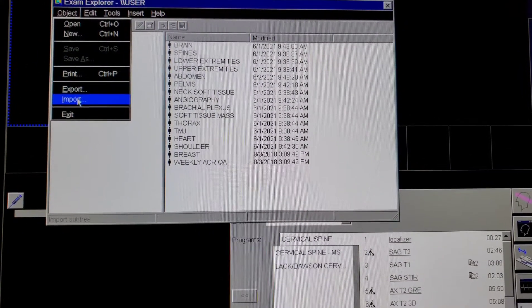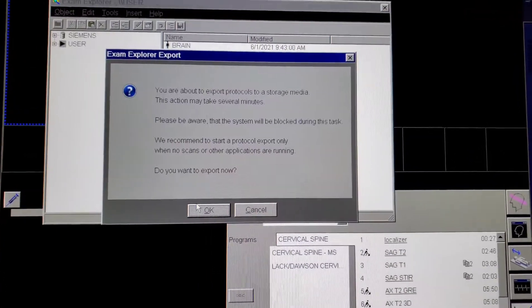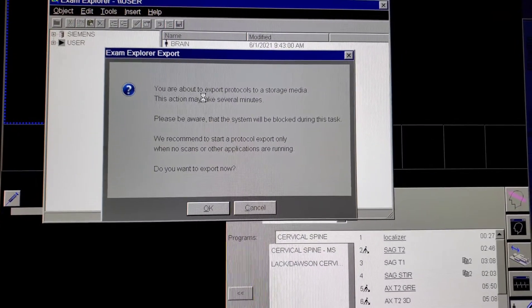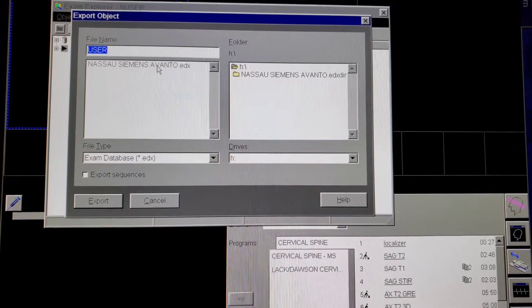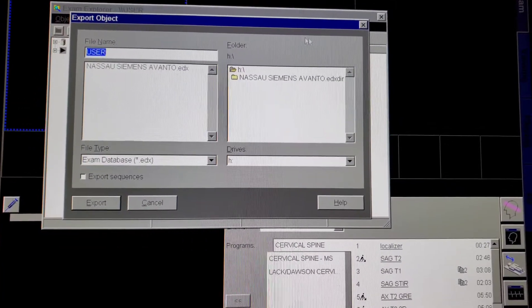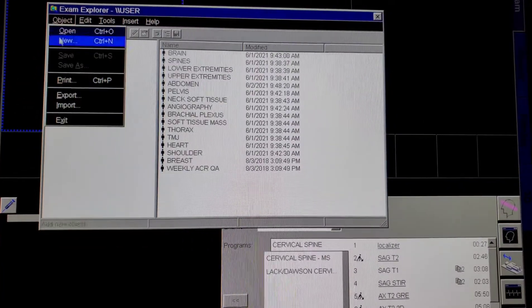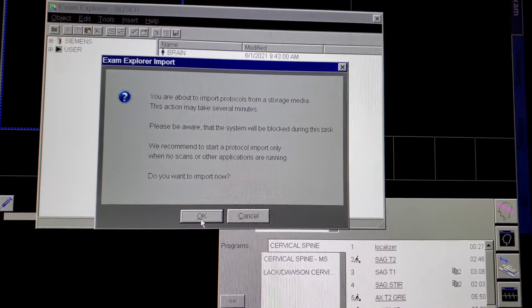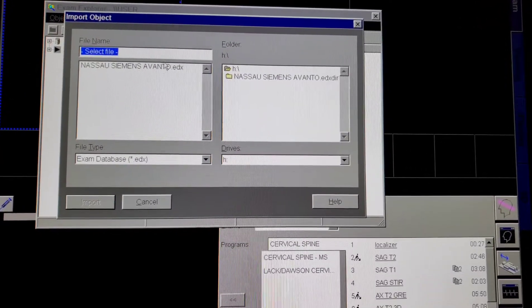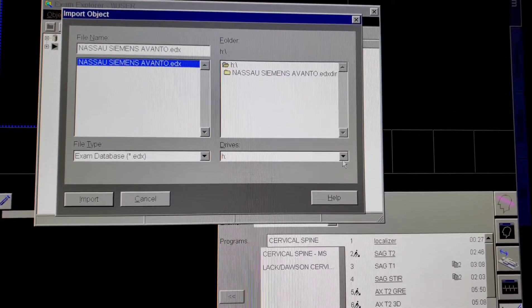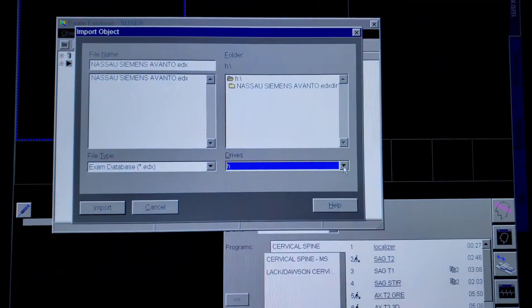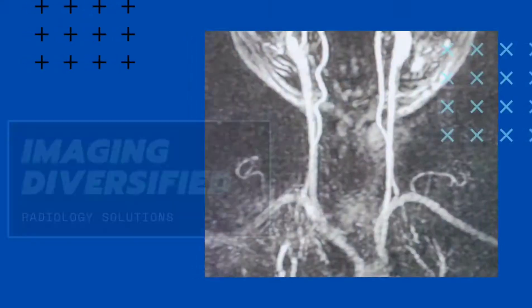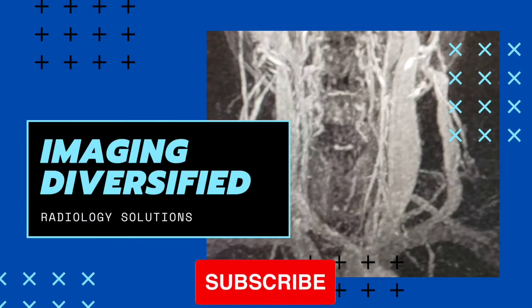And that is how you export and import. Import is the same exact way. Object, import, select the file from the H drive. Usually when it is in the front right there. Alright, easy breezy.